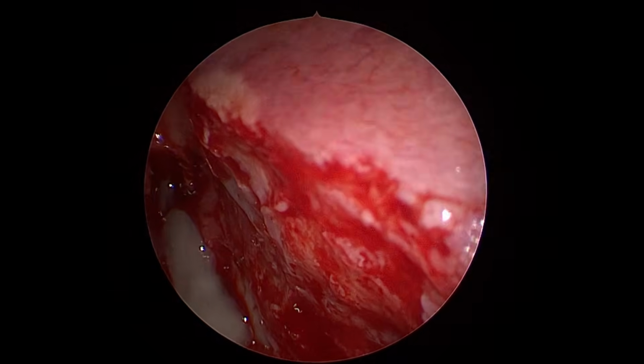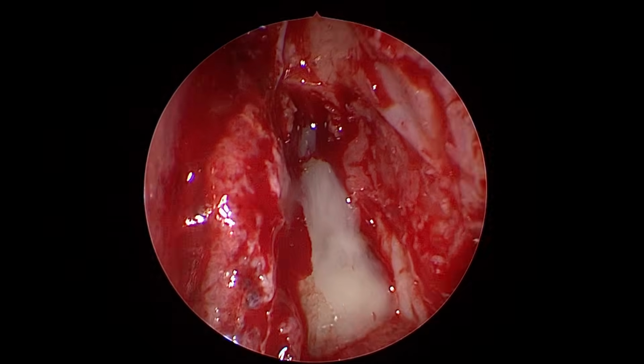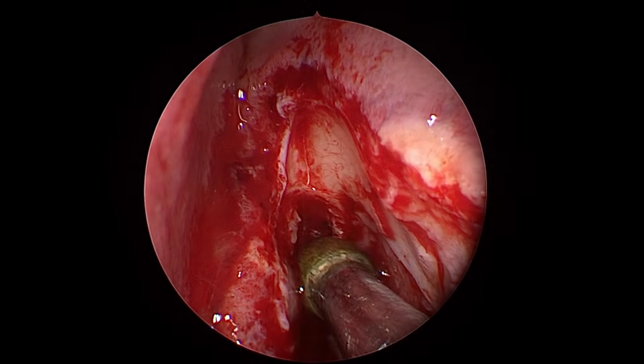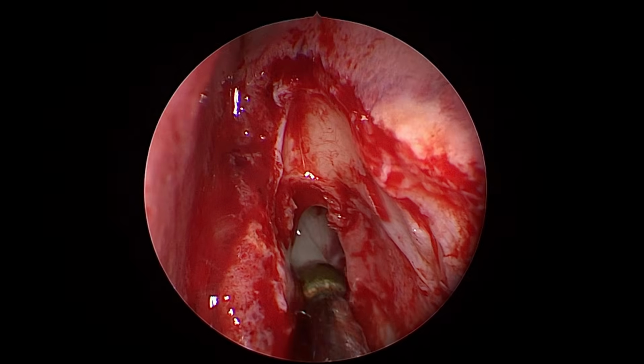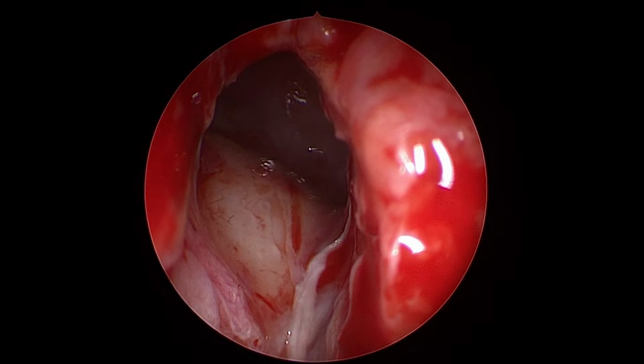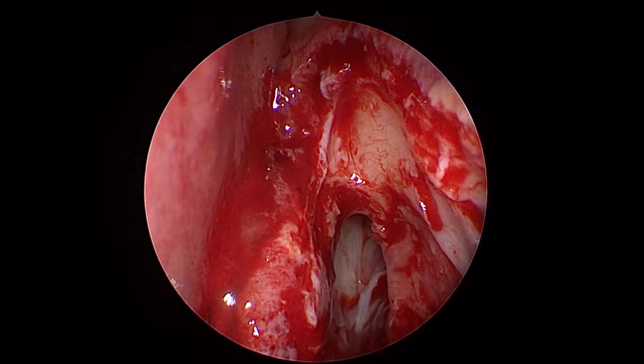This is only possible because you read the CT or the imaging very correctly. So it is always worthwhile to spend time reading your CT. 100%, no doubt about it, CT scan is a must. See now, the frontal. How easily I could reach it. If anybody looks at the axilla and follows the beak, they can reach the frontal easily. Easiest sinus to open, I would say. Use the 70 degree and keep your eyes on the landmark.